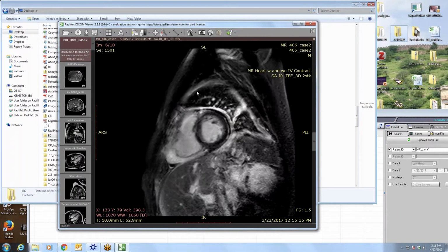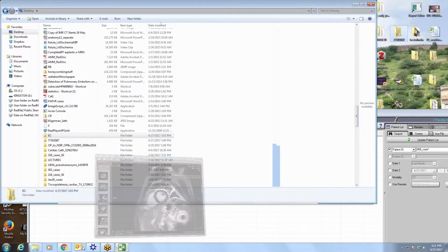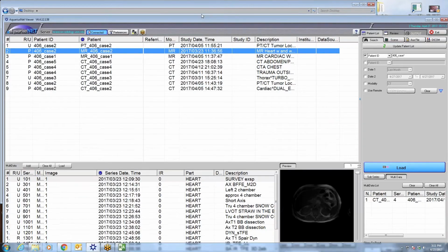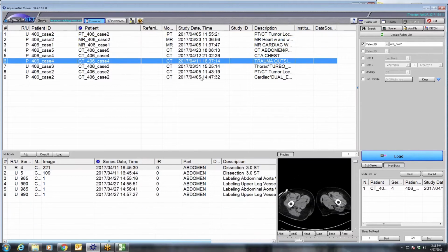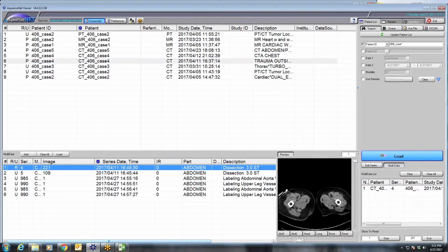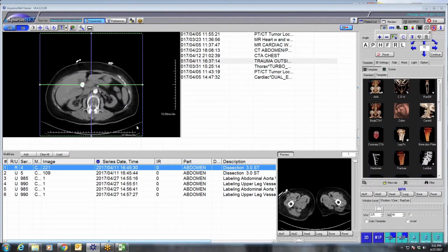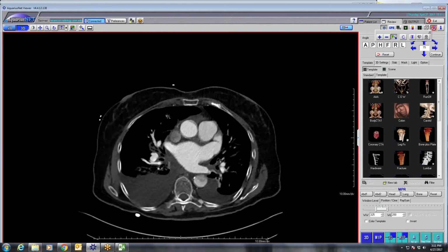What kind of scanner was it done on? That would be the other thing. The outside, I don't know. The first study I showed was an outside study, and the second, I don't know what Stephen says, trauma outside. Yeah, you can probably look at the DICOM header and see if it was a super fast scanner, if that contributes to it. I don't know.